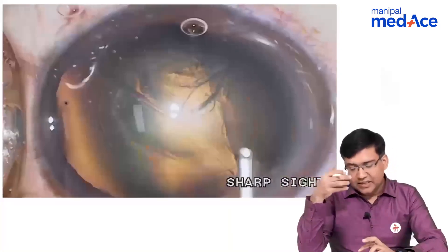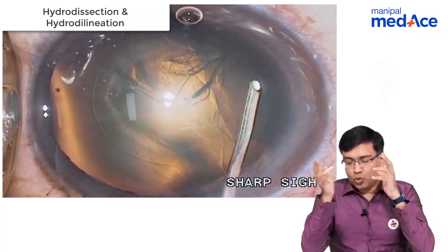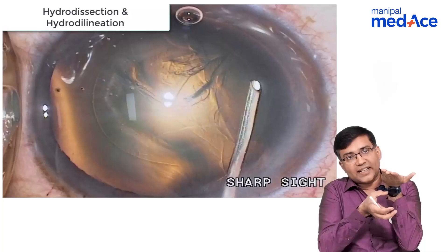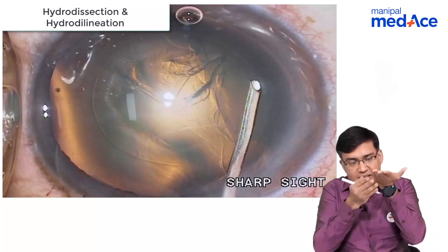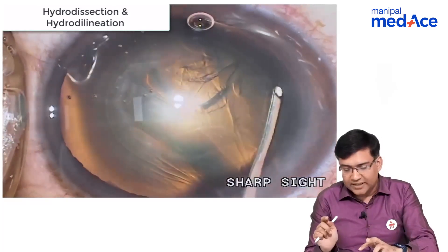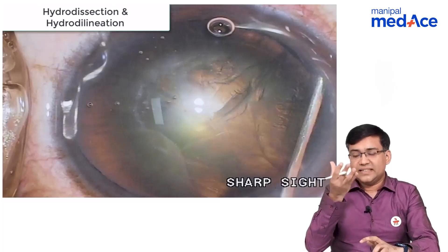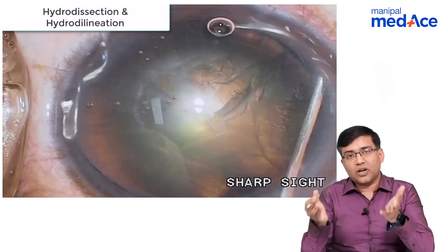After we have done a continuous curvilinear capsulorhexis, the next step is we basically do a hydrodissection. In hydrodissection, we basically remove the attachment of the capsule from the underlying cortex. We have put a cannula inside going just beneath the anterior capsular margin and putting the fluid there. You can see there is a wave going on — that wave tells us that the capsule has now separated from the rest of the cortical material.